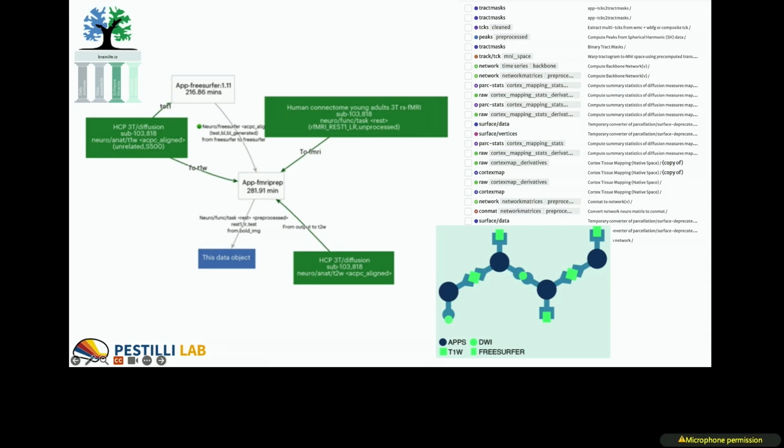And we also have a cool provenance graph. The provenance graph is all the steps that you did to get to the data that you're looking at. So in this example, we have resting state fMRI and, no sorry, T1 imaging, going through FreeSurfer and going through fMRIPrep and finishing up in a preprocessed BOLD image. Interesting. So you can think about these as sort of protein structures that can only glue together with certain receptors, and we have everything tracked for you.